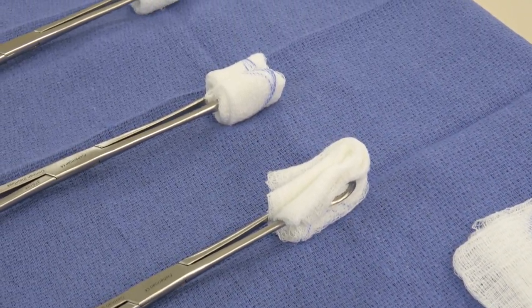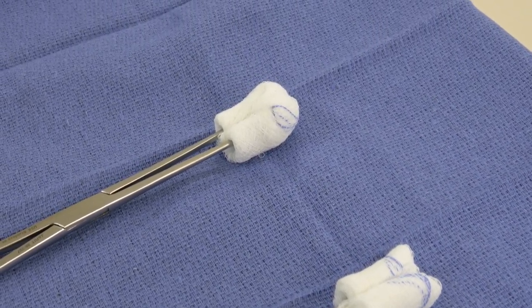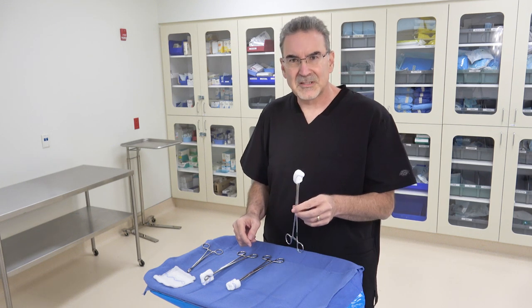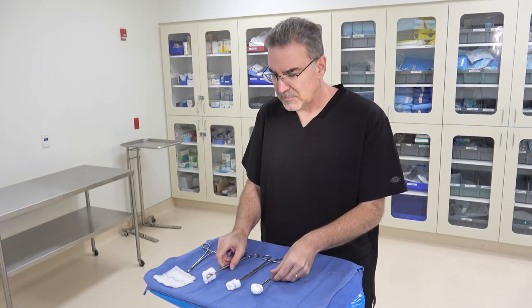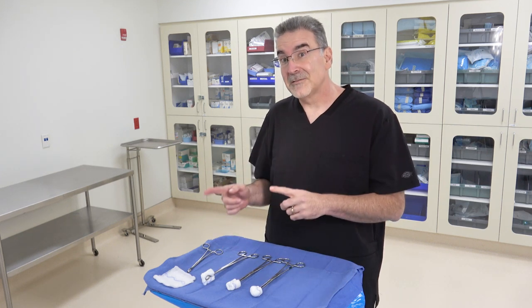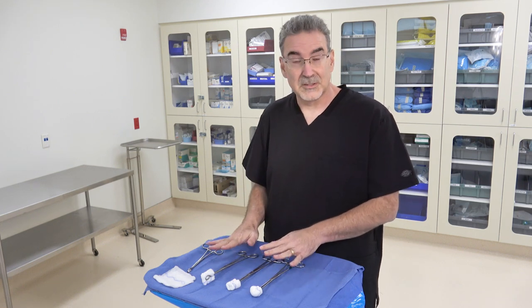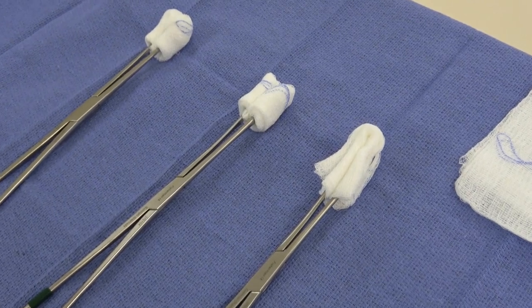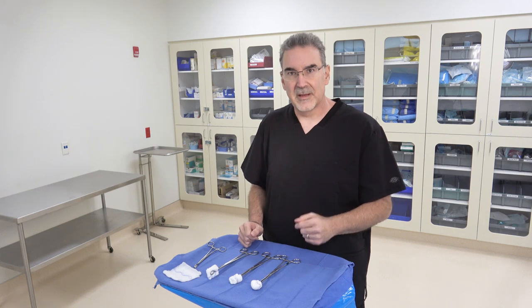As you start making sponge sticks, you'll probably find a preference. But also keep in mind the time each takes — the third method takes a second or two longer, which can matter in a time crunch. It's not just your preference either — some surgeons have a preference for how they like their sponge sticks folded. So make sure you learn all three ways, so you're able to make the right one for each surgeon.